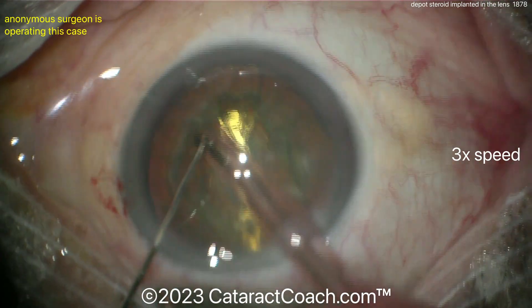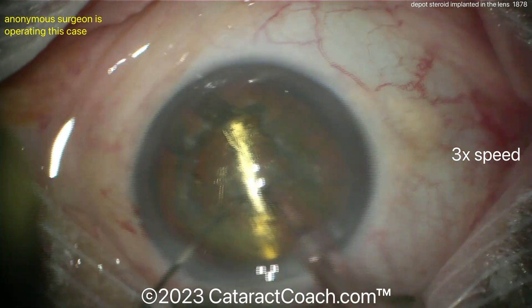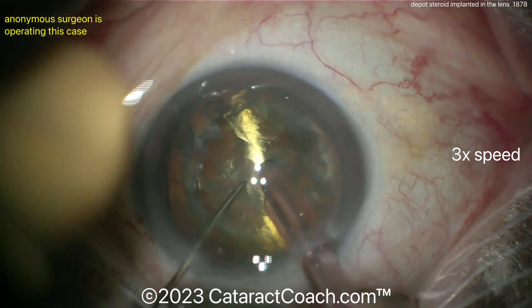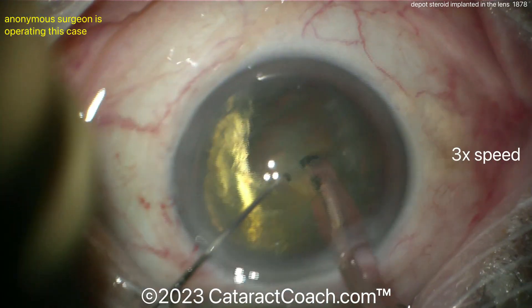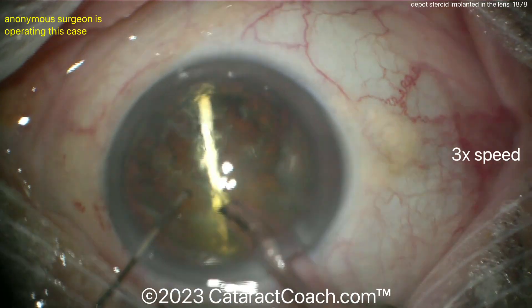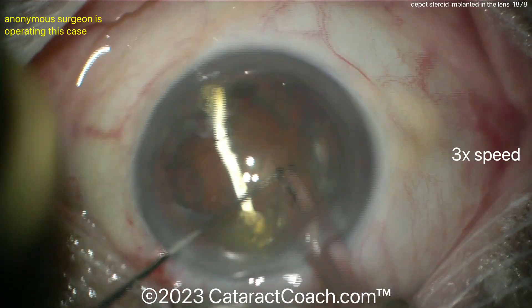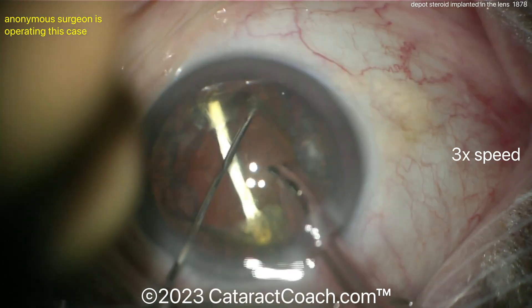I wanted to show you this case because it's very interesting — I've never seen this before. Using the phaco probe to take down the relatively soft lens material, and there's that big steroid implant. I'd use a hook right now to lift it up, get it out of the capsular bag into the anterior chamber, and then pull it out of the eye.